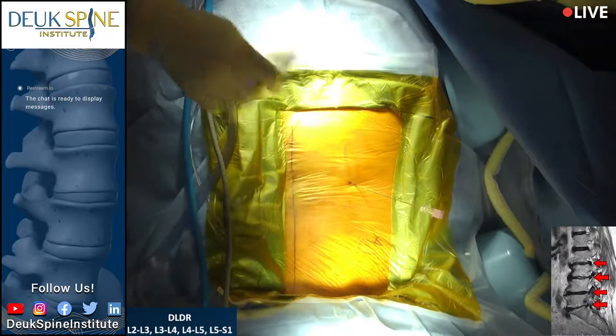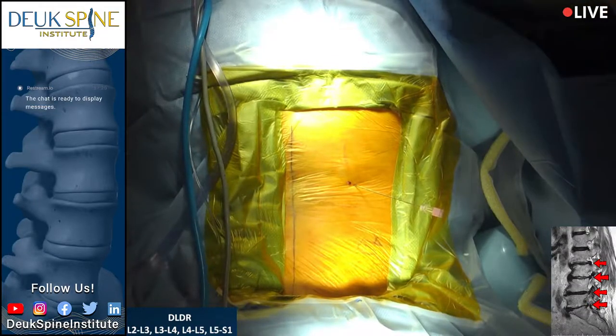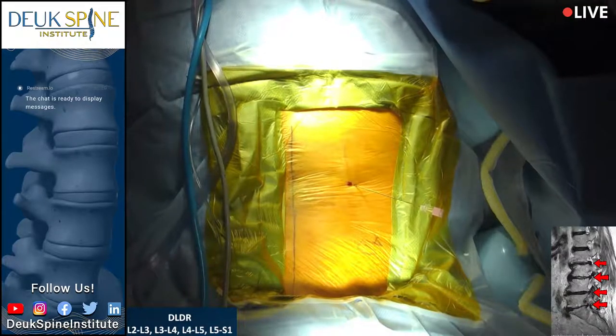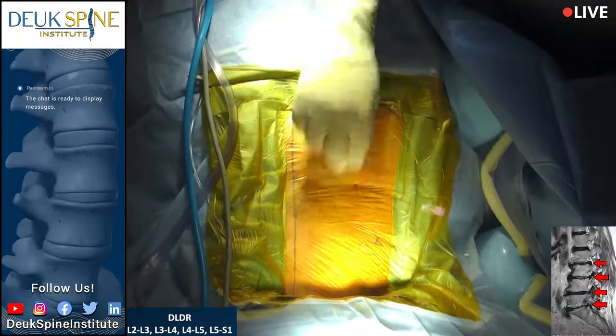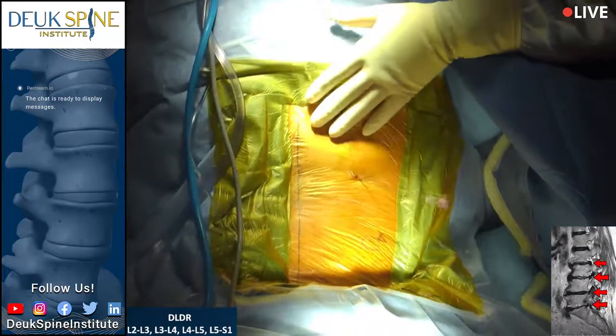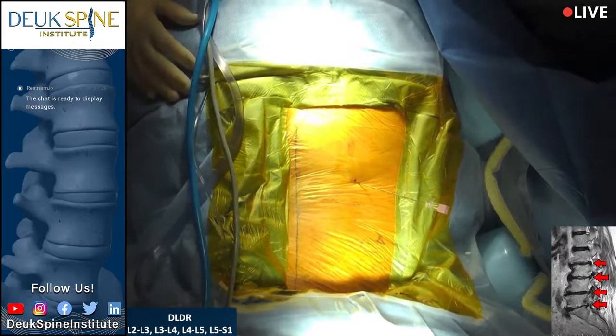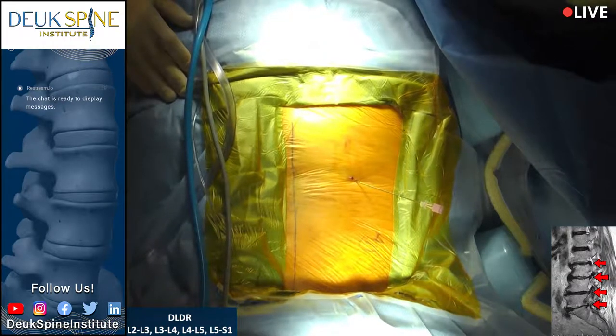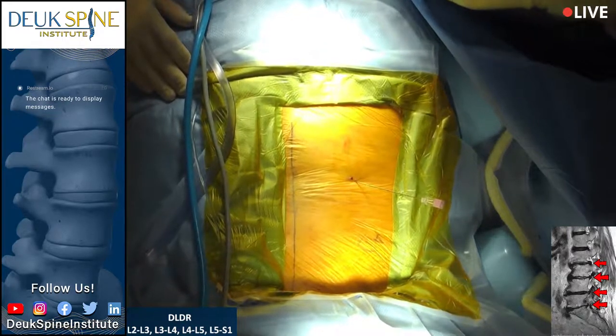Now, this patient has pretty severe degenerative disc disease, okay? And yeah, it's worse. Let's see what that does. The first thing I need to do is set up the X-ray. For those of you watching for the first time, we use an X-ray machine in the operating room called a fluoroscope. Lay still, all right? It requires that we line up the machine with the spine on the lateral axis and the front-back axis.